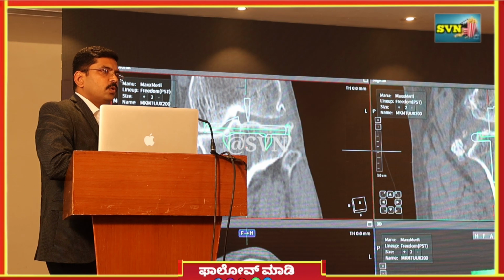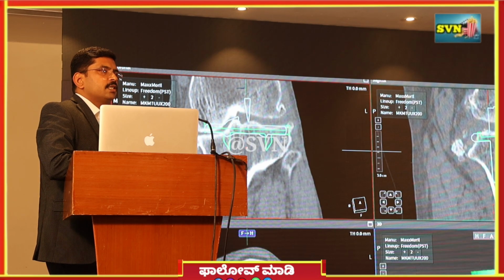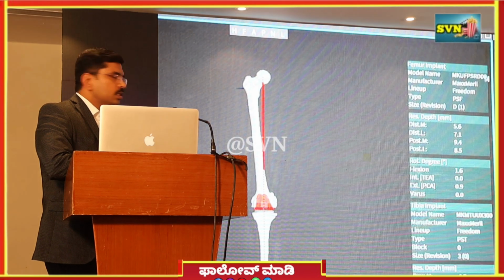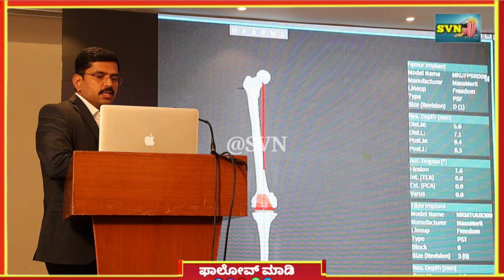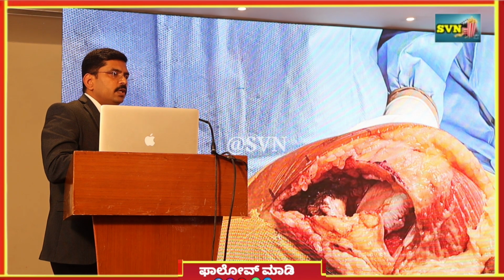So since we know all these parameters very early, it is very easy for us to do a surgery. Definitely the surgery happens faster. So since the surgery was going faster, we would combine both the knee surgeries together without much difficulty. So this is how the plan would look. Since our robo is a small pen-like thing which works with a small burr, it can go in between a small space and do the job and come back. So that's why my incision, my cut wound on the surgery, might not be a bigger one.